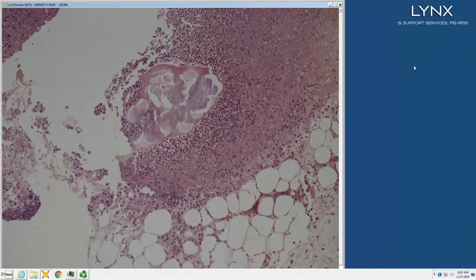To one of the dermpath fellows, what is the most important simulant of pancreatic panniculitis histologically? Yeah, mucor. So you can get panniculitis like fat necrosis surrounding mucor. So pancreatic panniculitis versus systemic mucormycosis, big difference. So you want to make sure anytime you see pancreatic fat necrosis, you want to look closer and make sure there's not mucor hiding in there.